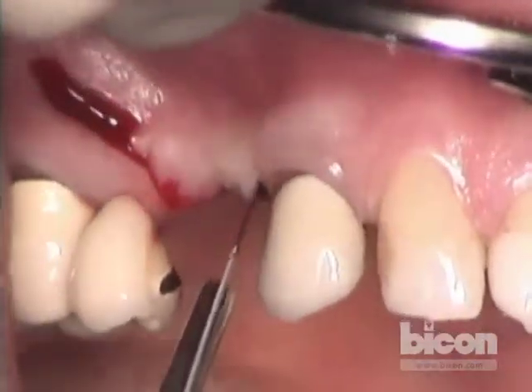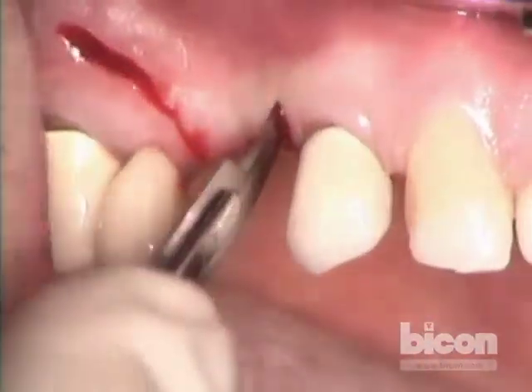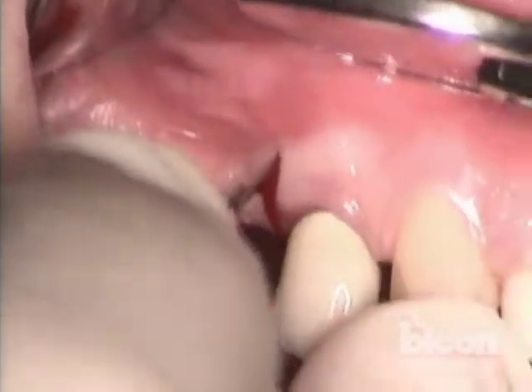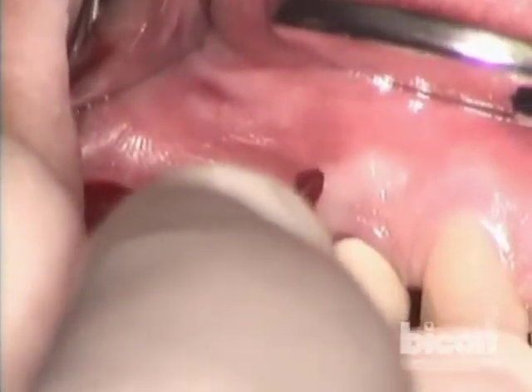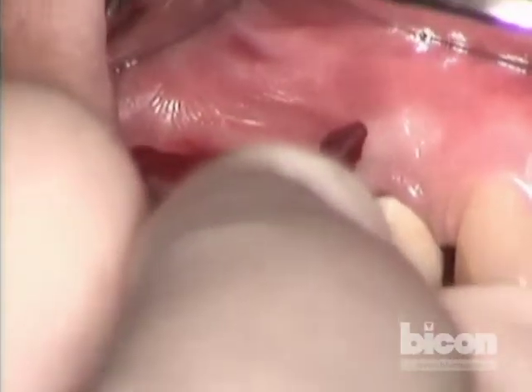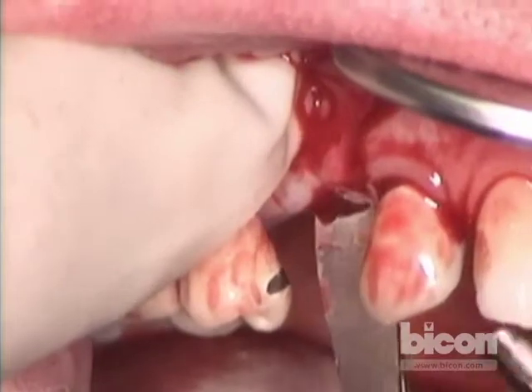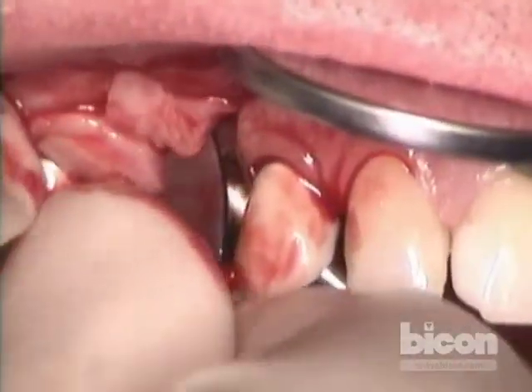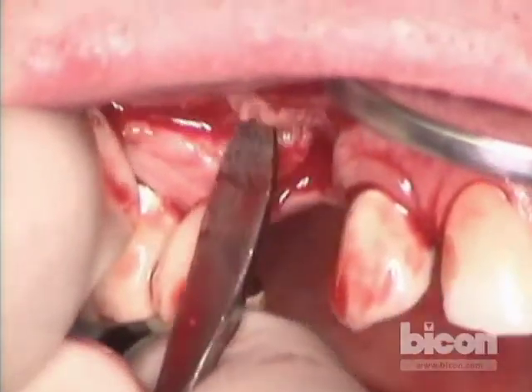We have used no epinephrine in this case as per the patient's request, so we'll have a little bit more suction necessary. And again, we will extend our incision slightly anteriorly, slide, come out. So you just kind of lift it up.